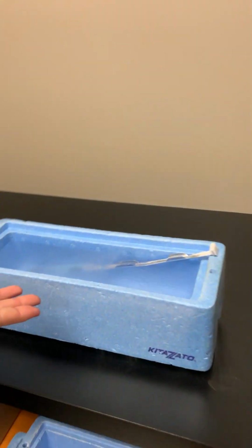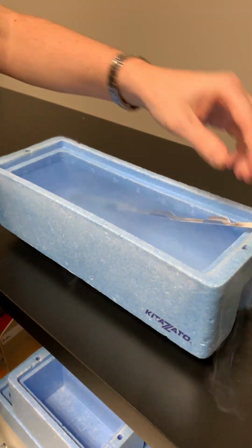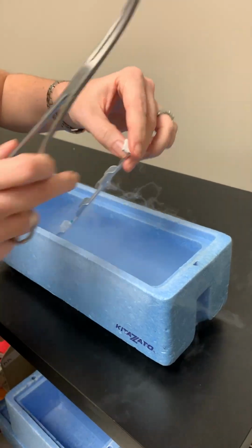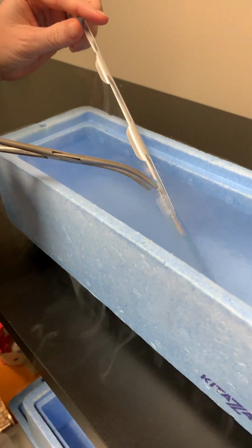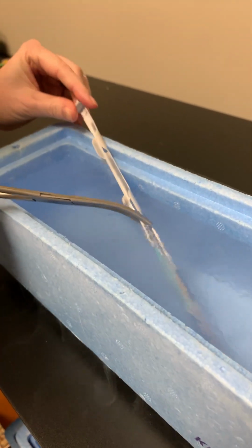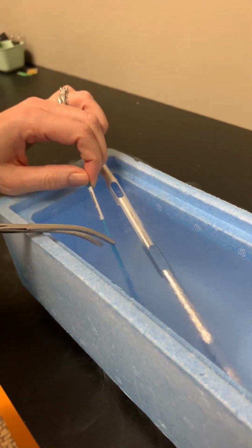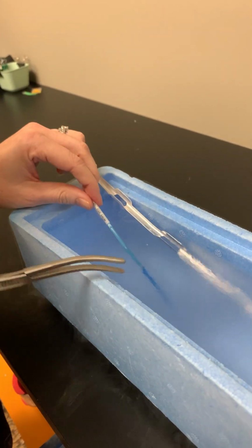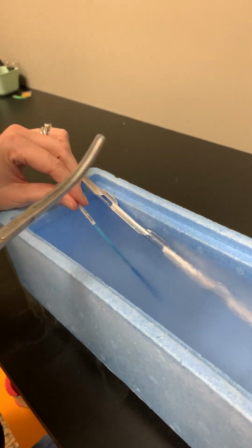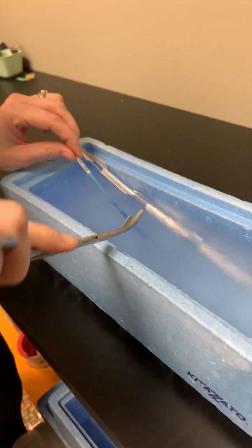So if we come on over here, we've got a little vat of liquid nitrogen, and I can show you what it would look like to bring an embryo off of this. So this is what we call our cane. And then down in the bottom we have a goblet that's holding the device that our embryos are frozen on. I've got some fake information on here, so don't worry, I'm not doing any HIPAA violations, it's my own information. So we've got what's called a Vitrigard, which you can use any type of device. And when we're thawing or freezing an embryo, you always have to keep the device tip where the embryo is stored under liquid nitrogen until you want it to thaw.